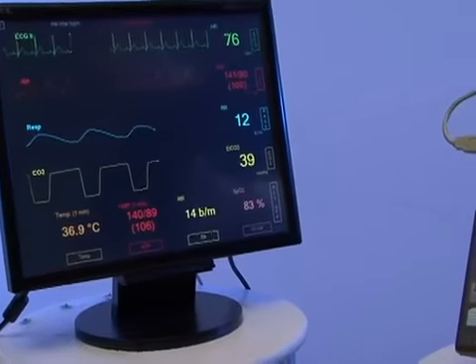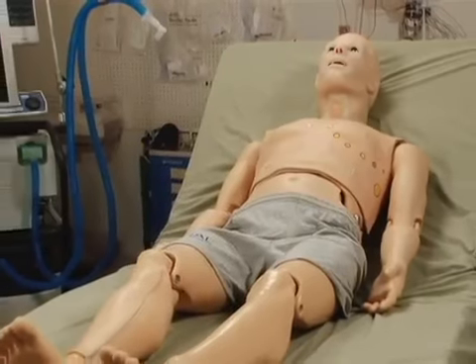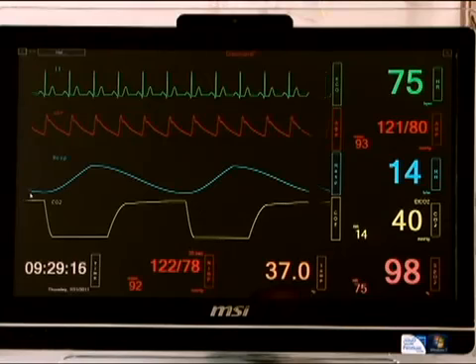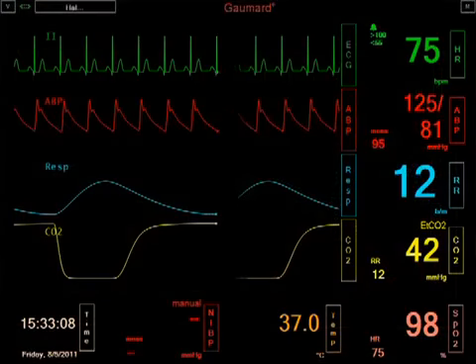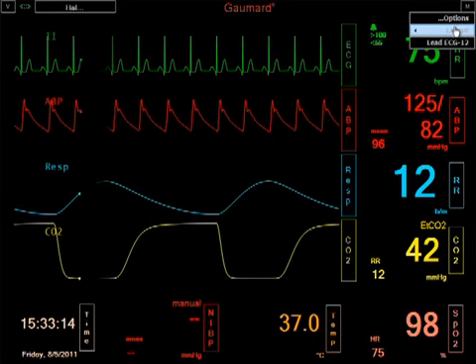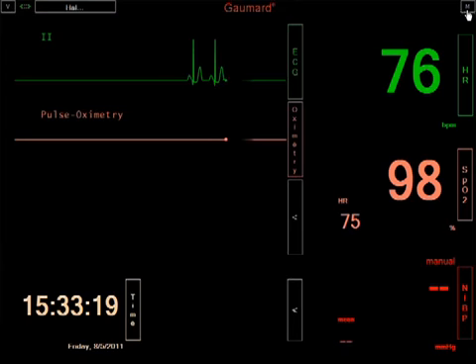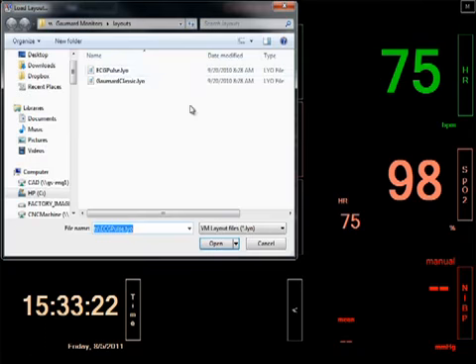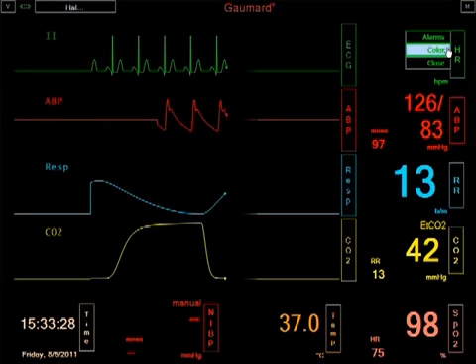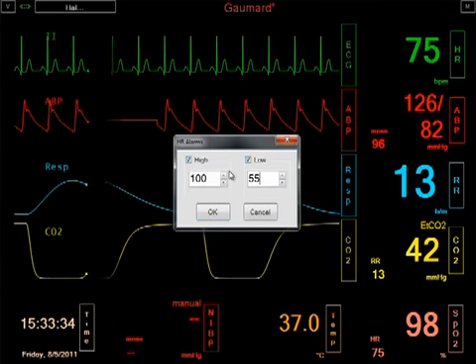For additional realism, virtual vital signs monitors are available in both fixed and mobile formats. The S3201 comes standard with a fixed monitor. The vital signs monitor is controlled wirelessly through the tablet PC. Use a selected configuration or create your own configuration to mimic the real monitors used in your facility. Customize alarms and share images such as ultrasounds, CT scans, lab results, and more.